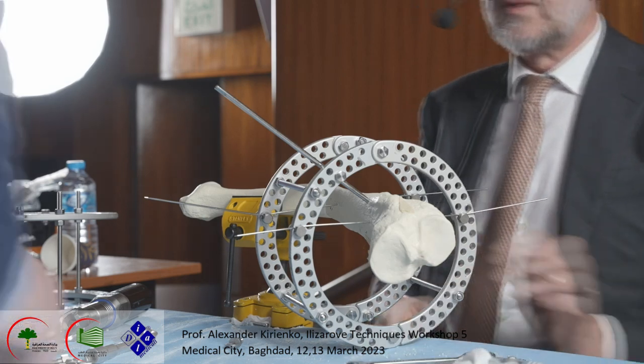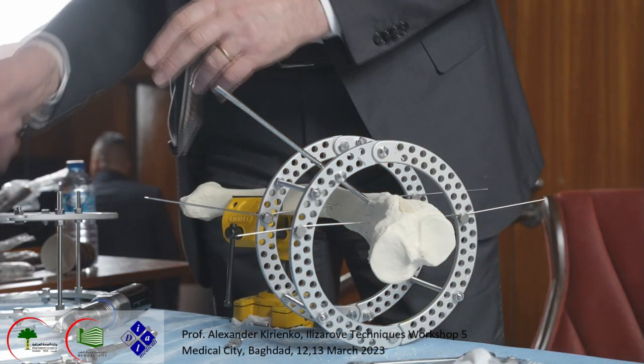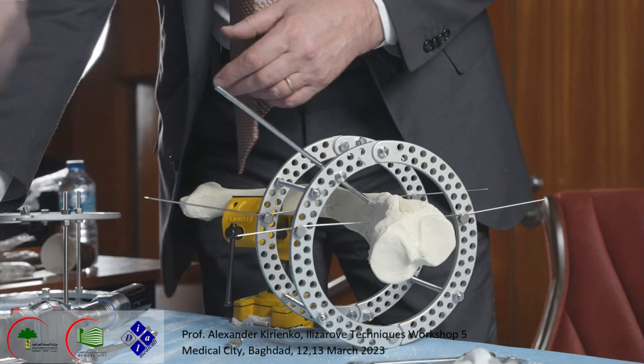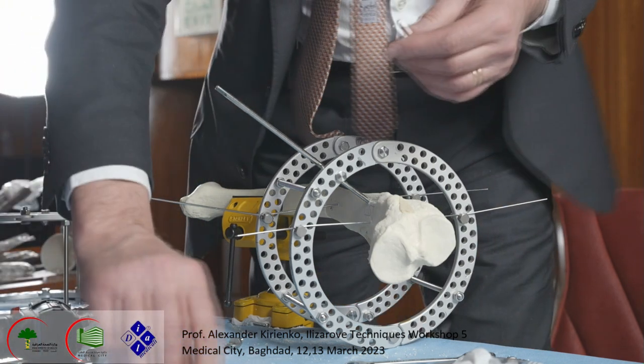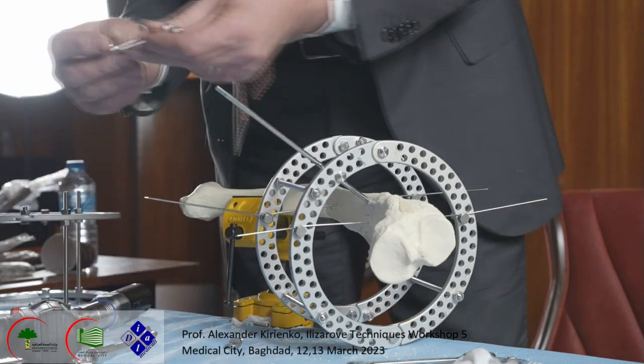After that, I use the rods with the female. Maybe we use this, not so long. This one, this 8. Okay, we build again the hinges. You take a rod, two nuts.